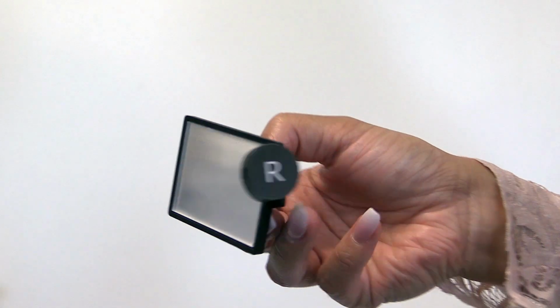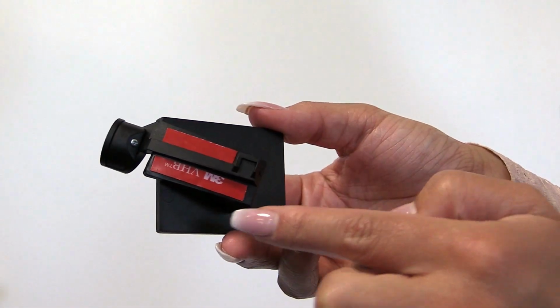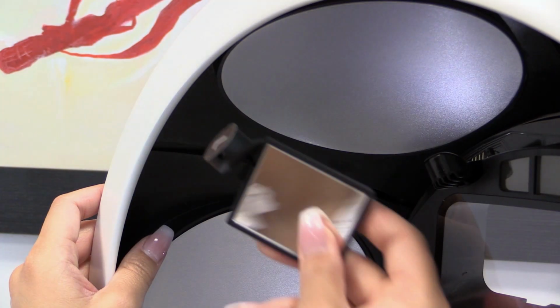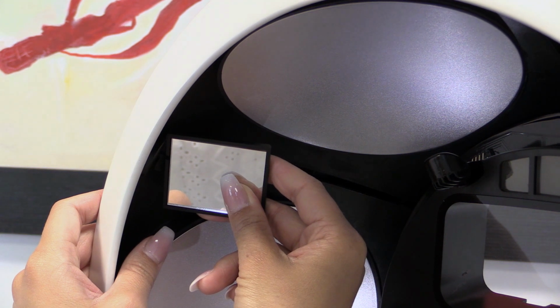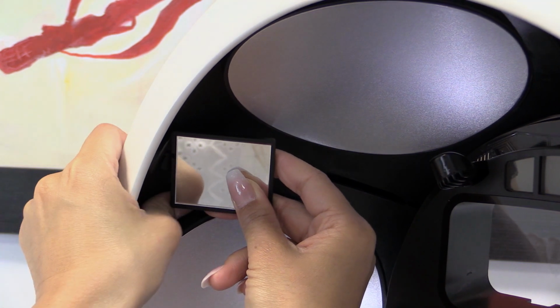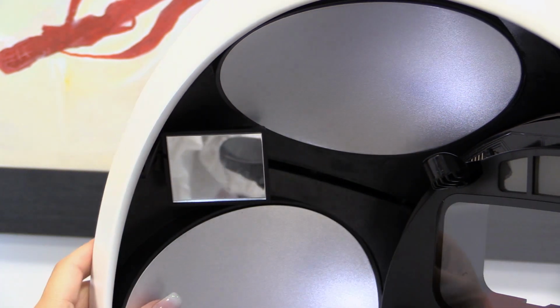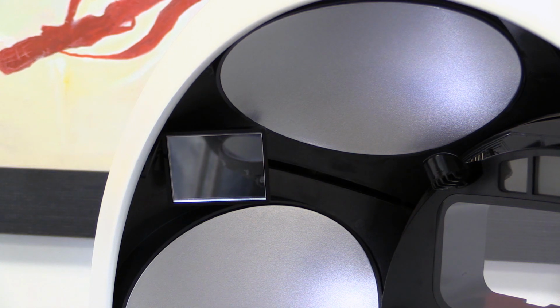If you want to attach the mirrors permanently, first remove the protective foil from the adhesive tape on the back. If not, you can leave the protection foil on. To attach the mirrors, place the magnetized part of the mirrors against the inside edge of the Observe and it will click into place. To secure it, push the lower edge of the gap inside the Observe slightly down and hook the back of the mirror into the upper edge of the gap with a rotating movement. Do not hesitate to apply some pressure.